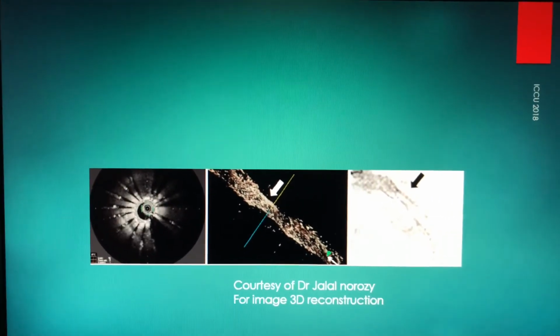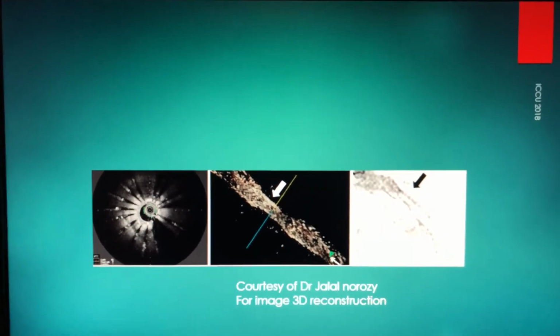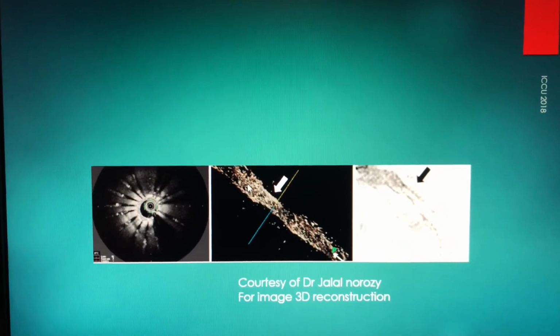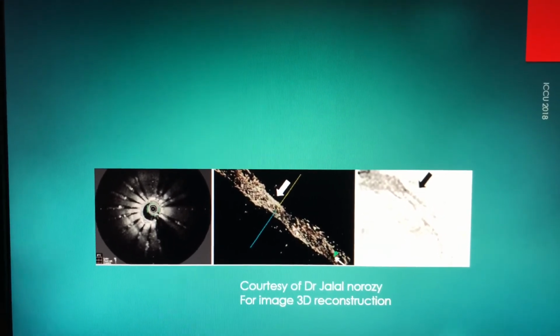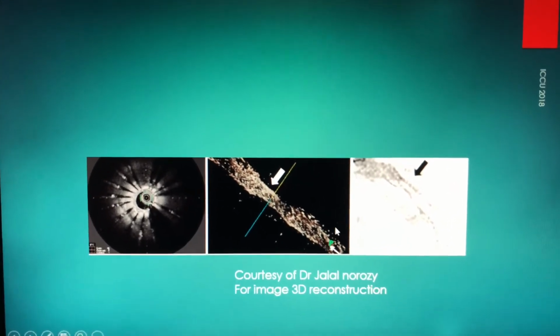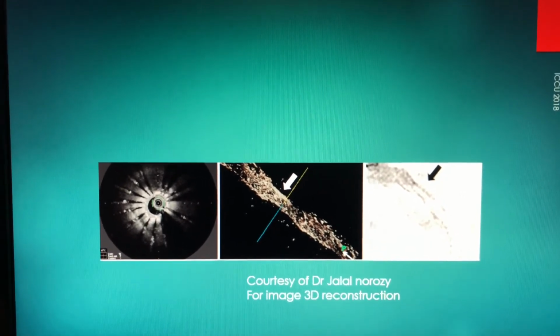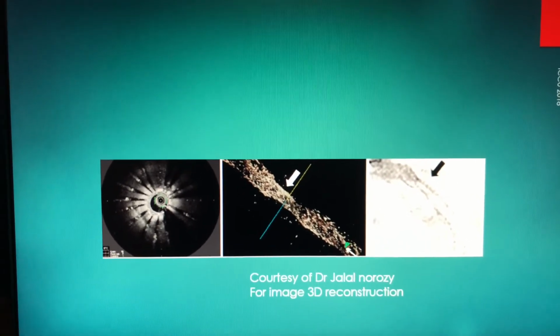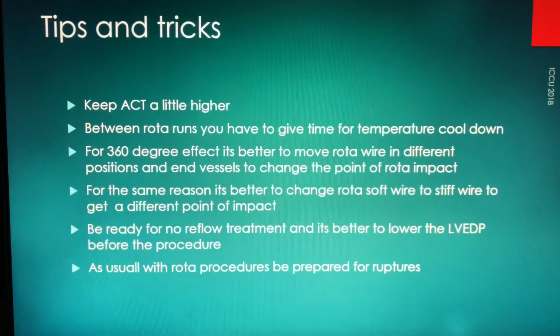And this is courtesy of Dr. Jalal Norouzi for 3D image reconstruction. As you can see, the whole idea behind the stent ablation is to literally ablate the stent and make it into some kind of powder, which is scary, but it doesn't affect the distal bed at all in our experience, which is a couple of patients now. We have a very low rate of no reflow phenomenon.